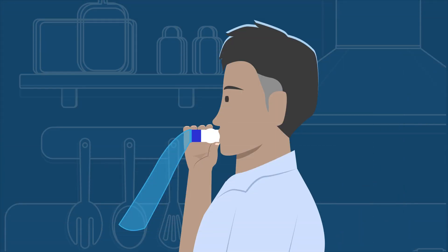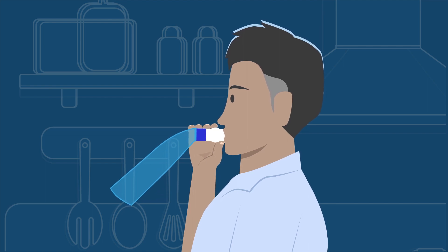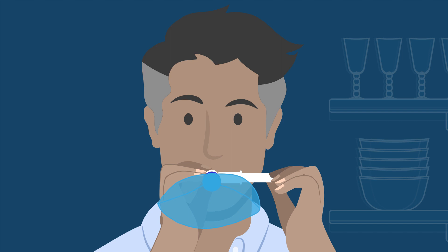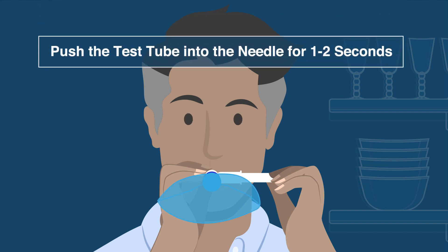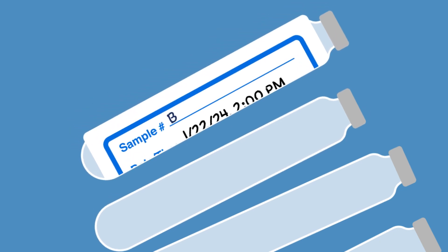Hold your collection tube next to the collection device but do not puncture it yet. Place your mouth over the collection device and exhale to see the bag inflate. In the middle of breathing out, push the test tube into the needle for 1 to 2 seconds, then take the test tube off the needle before you finish exhaling. That was your baseline sample. You can now apply the label with the collection time and place the tube off to the side.